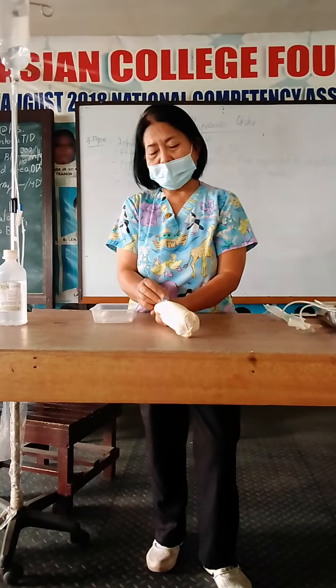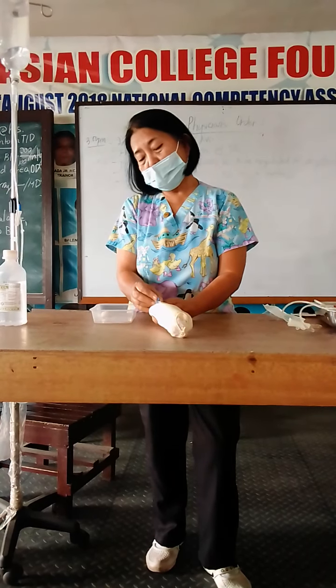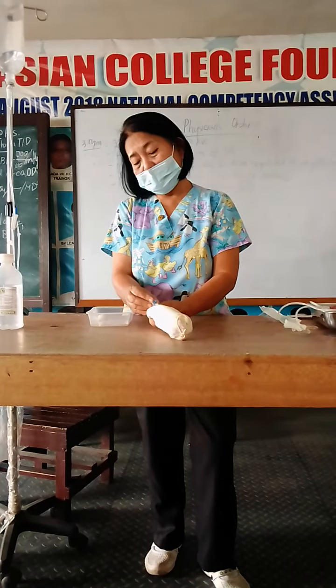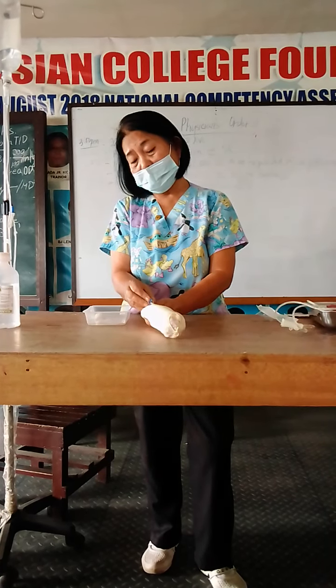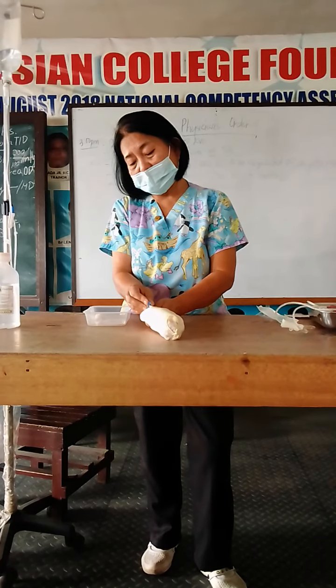You decrease it to 10, and then you parallel it up to the vein. You check for the backflow. If there is none, you have to search for the vein, then you do it straight. This is quite difficult, class, because it's not made of the patient's skin. Very difficult to straighten because it's not skin, so it's quite hard.